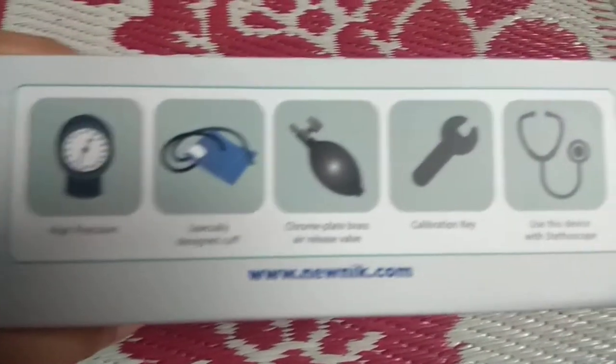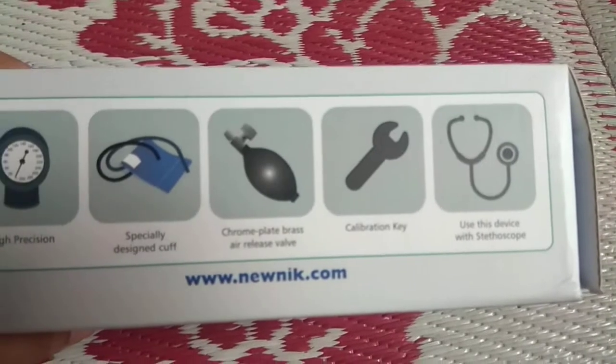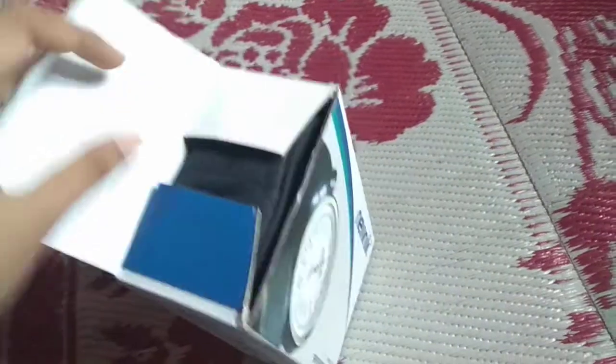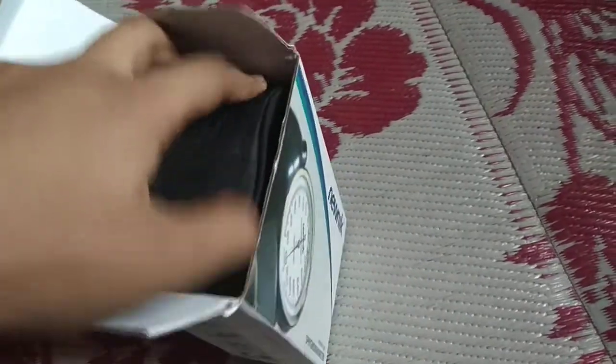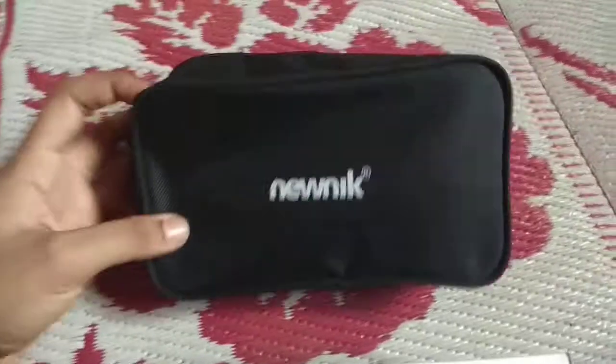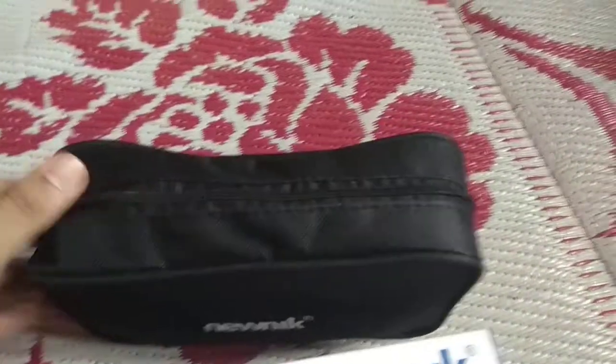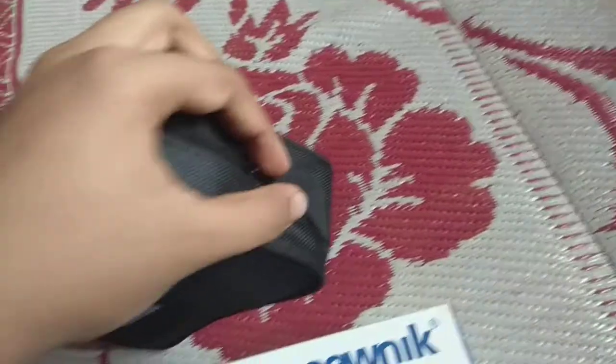These are all what you get inside the box. Now let's open this. So you get a bag in which you will get the Spigma Manometer. Now let's open this up.